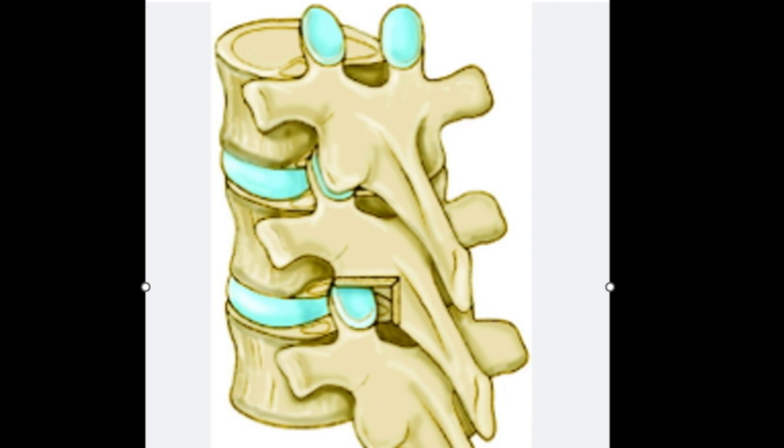Okay, so this is a typical thoracic vertebra or vertebral levels. You can note a few things down. Most spine surgeons know the anatomy of it, but the things specifically to be noted are that the superior and the inferior articular facets are coronal in shape.